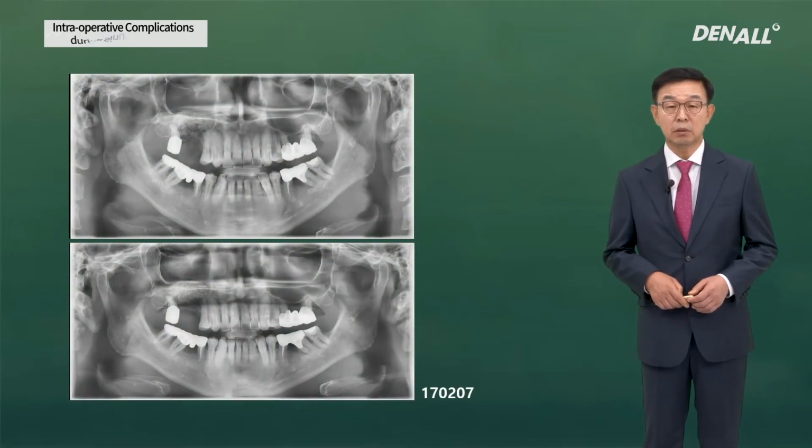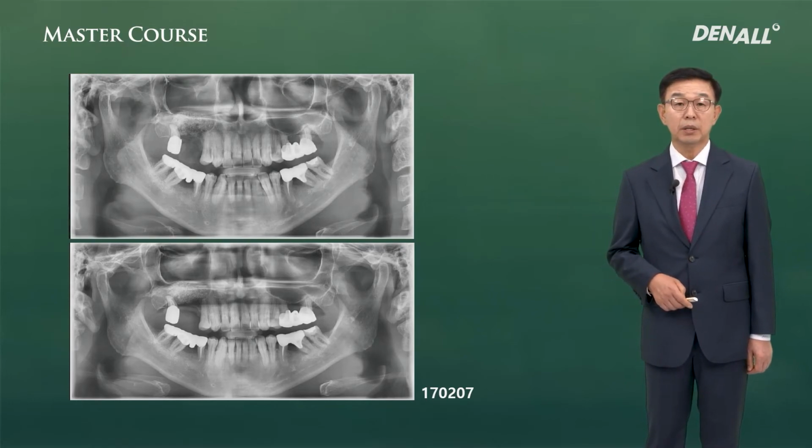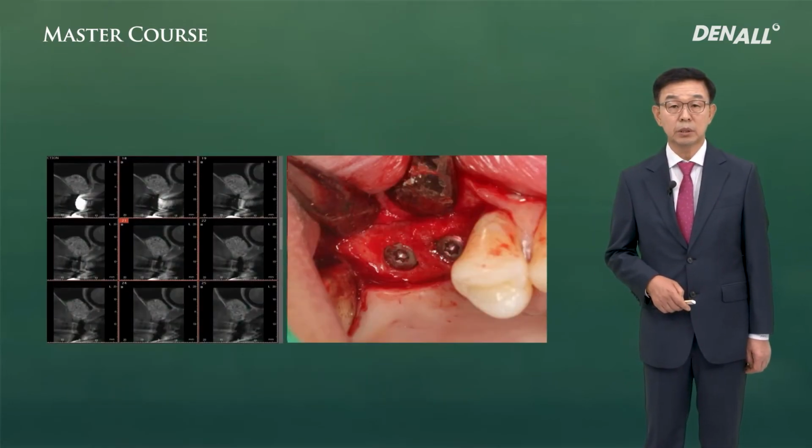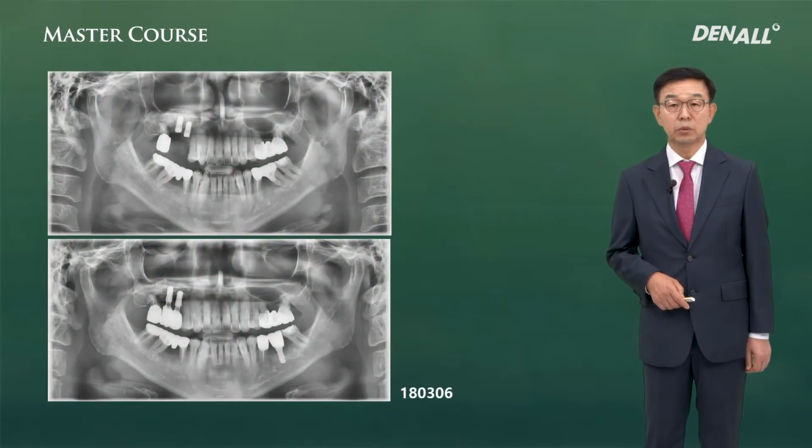And in order to provide a safer treatment, the bone graft was done. I waited sufficiently. After 5 to 6 months, I did secondary surgery. 2-stage method was used to place the implant and prosthesis was delivered.